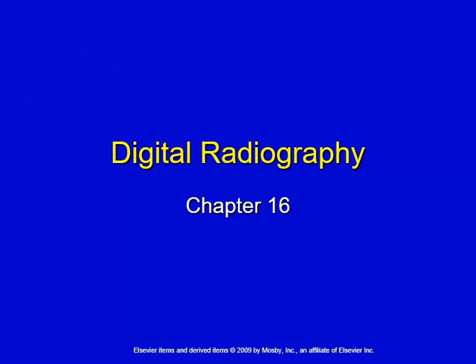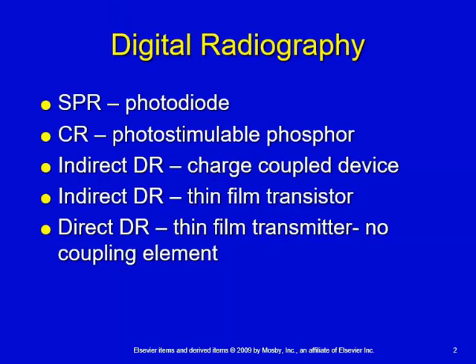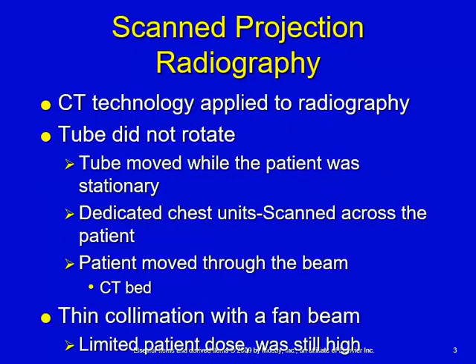What we're going to do in Chapter 16 is review scan projection radiography, briefly review CR, and then we're going to talk about indirect capture DR. Scan projection radiography is technology that was adopted from CT.